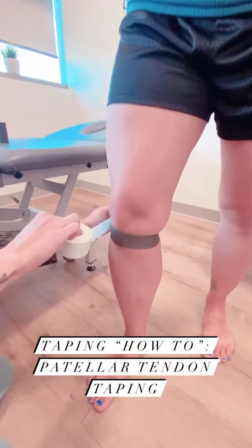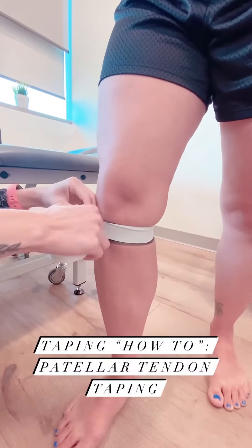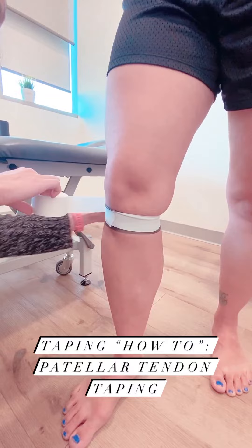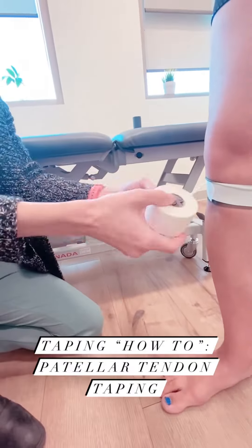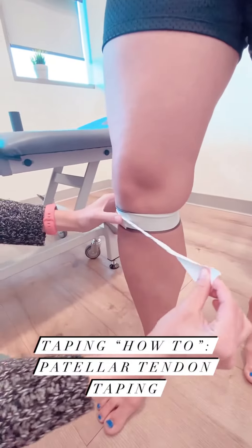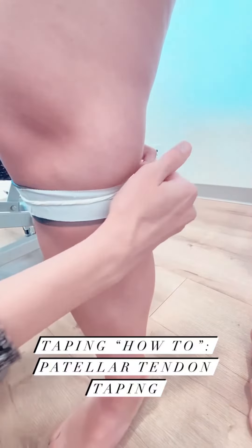I'm going to start off with just an anchor strip to give the tape something to stick to. For the next strip, I'll put a little bit more pressure on — I'm going to twist it and apply a little more tension as well, but not when I get right to the back.